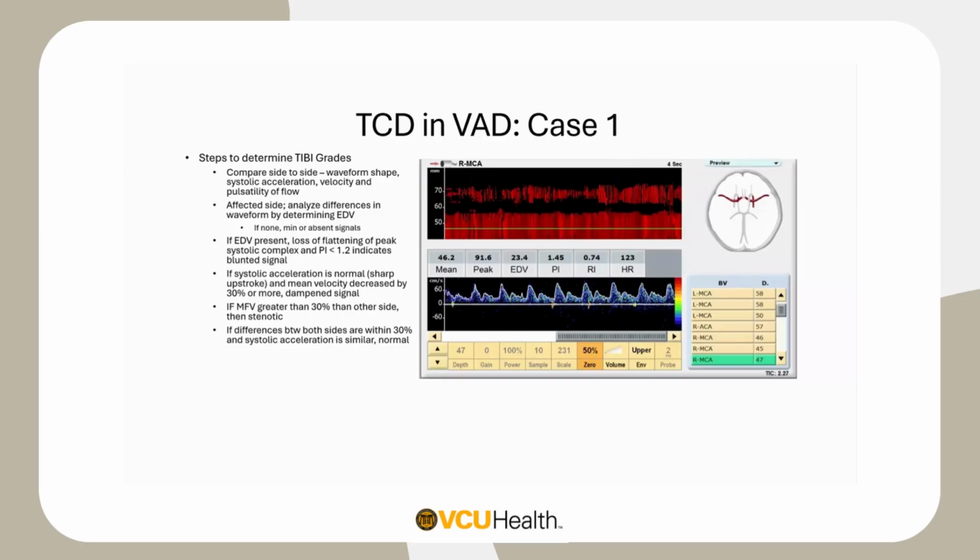I think the patient was on a lot of vasoactive agents and was unstable. The team really did not want to move the patient if at all possible, but they recognized there were new neurologic signs involved. I think in all our guidelines, if there's a stroke or concern of a stroke, we say, go emergently to imaging. I think in the CVICU, when you've got these complex patients on multiple drips, you have to do some convincing in those sort of situations.